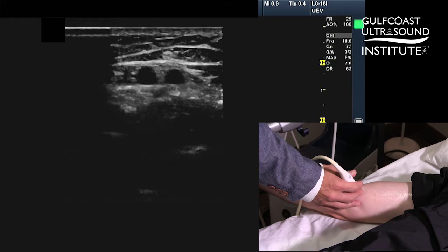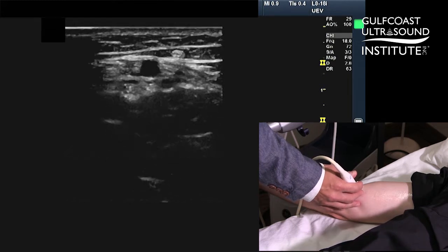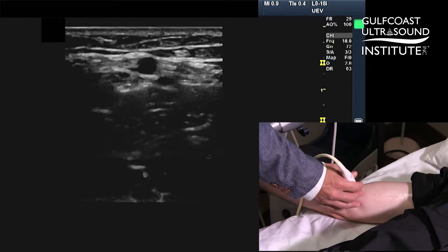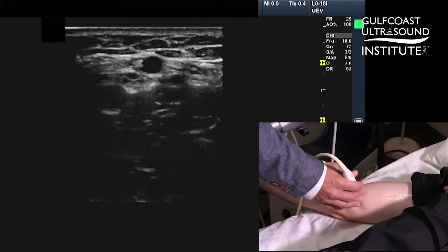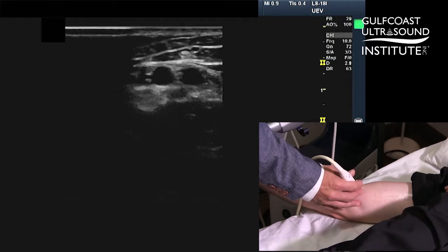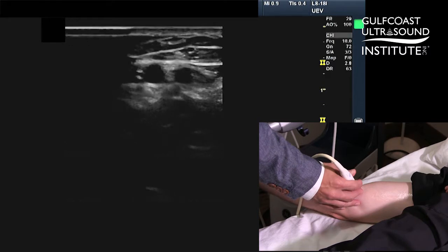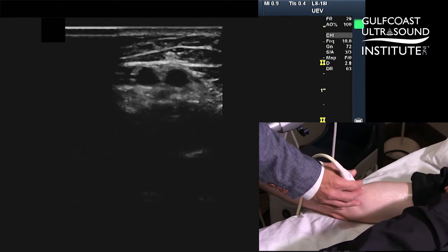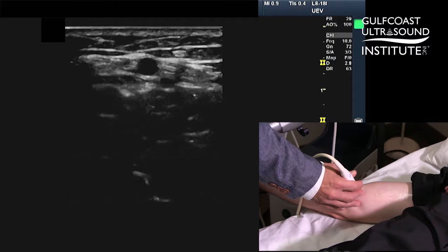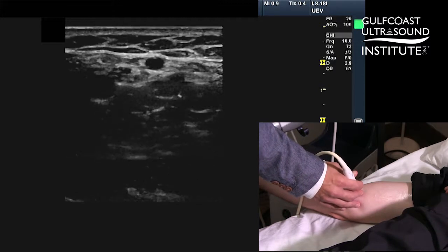The next thing I'm going to do is put just a little bit of pressure. Notice that with just a small amount of pressure, the vein collapses, and a little bit more pressure, the artery starts to pulsate. This is really the whole key — without even having to invoke duplex, Doppler, color, or any other fancy bells and whistles — just using standard two-dimensional echo, you can see the difference between a vein, which collapses, and an artery, which pulsates.